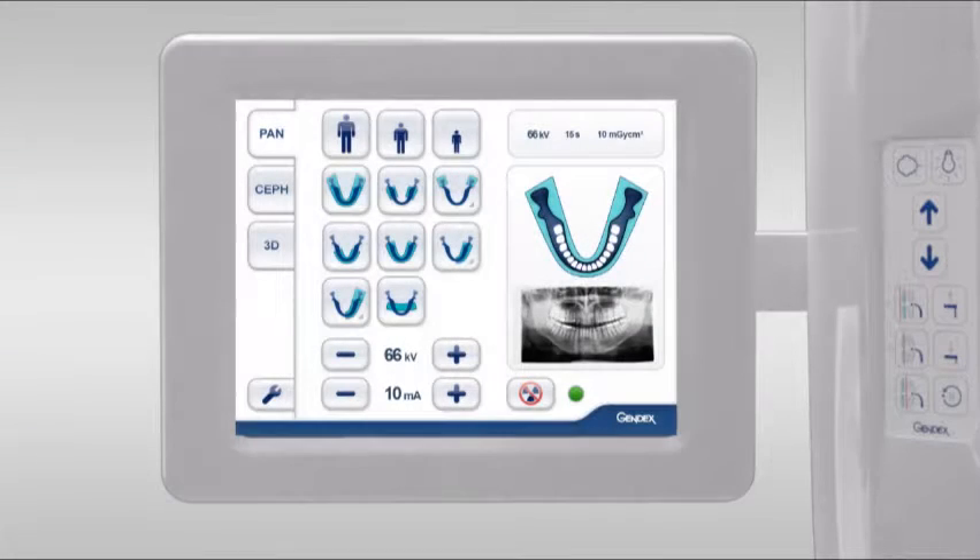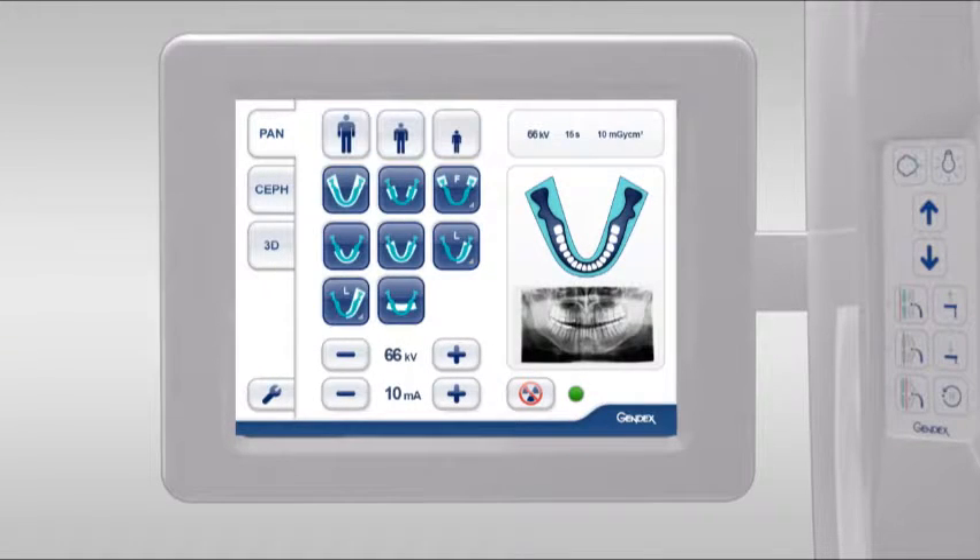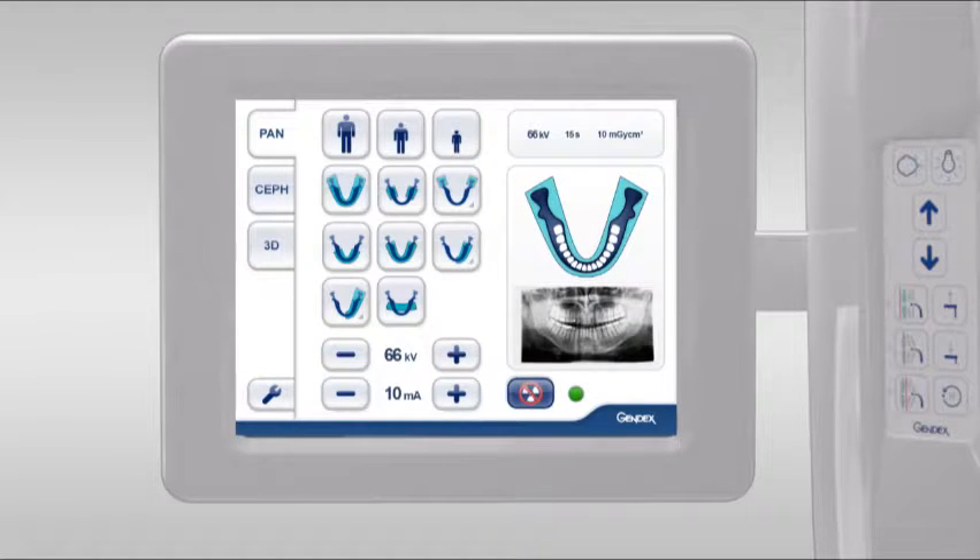The touch screen selections include body size, projection types, kilovolt and milliamp control, and a no-dose simulation. Displayed are system status, patient and dose information, as well as graphic and clinical examples of the selected projection.